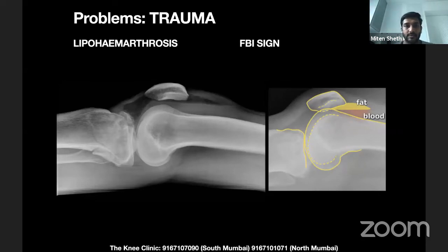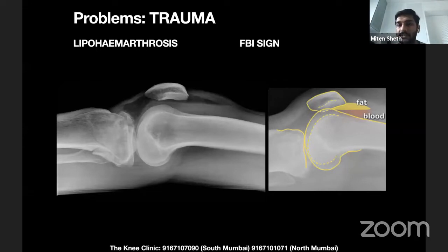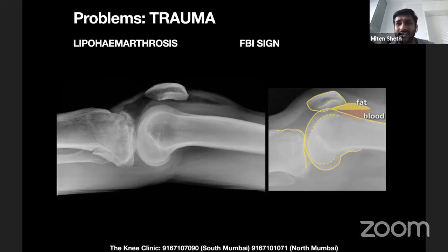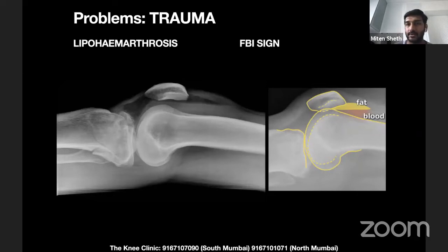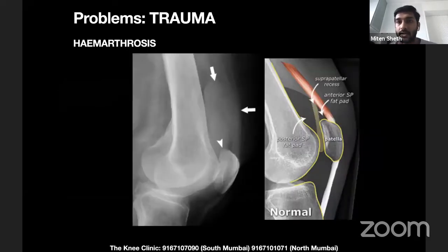In approximately 50% of cases involving a tibial plateau fracture, you'll see lipohemarthrosis. Some patients have violent injuries and fractures are directly visible on AP and lateral views. But in some patients there's only a hairline fracture. This subtle marker is called the FBI sign — the fat-blood interface. If you can see the fat-blood interface, it's not an ACL, PCL, or meniscal injury — something has broken. There is a bone injury, not just a soft tissue tear.